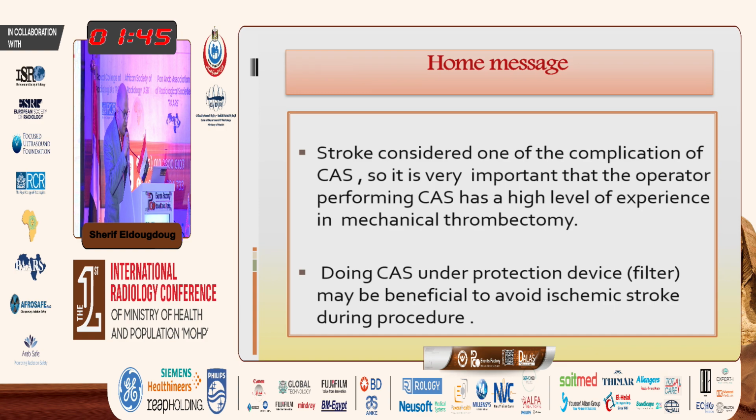The first take-home message is that stroke is considered one of the complications of CAS, so it's very important that the operator performing CAS has a high level of experience in mechanical thrombectomy. Doing CAS under a protection device may be beneficial to avoid ischemic stroke during the procedure.